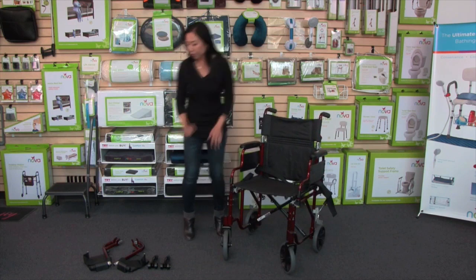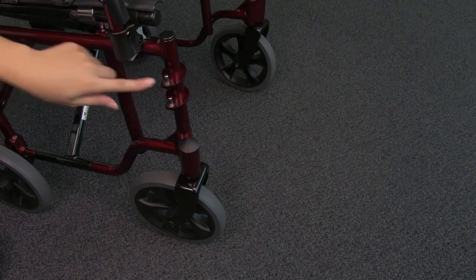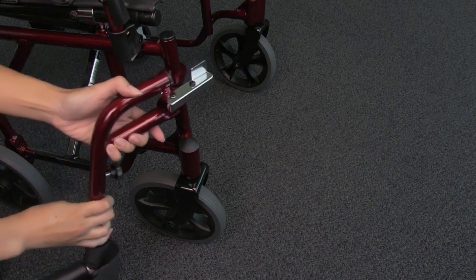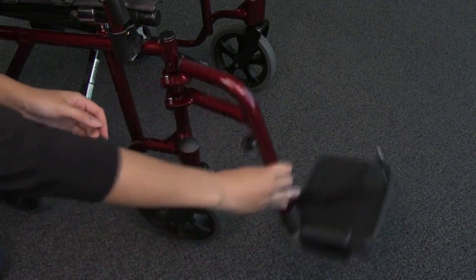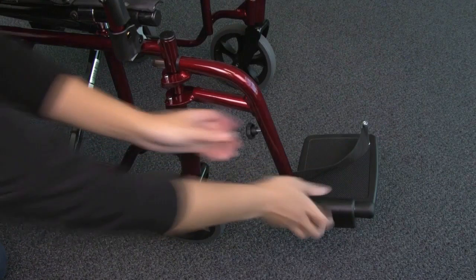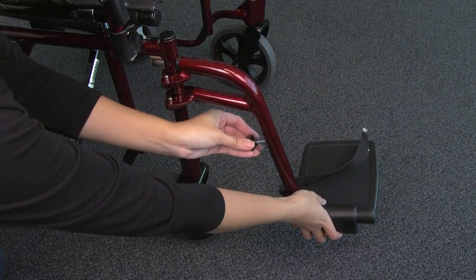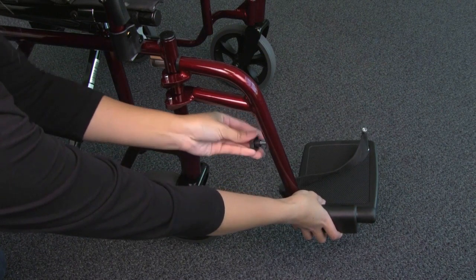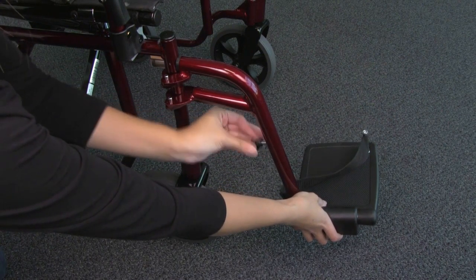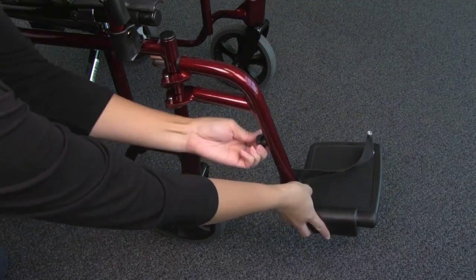To put on the footrests, you'll have two footrests, one for either side. You'll want the footplate to face inward, and you're just going to hang it over the pins and lock it in place. Notice the lever here is the same lever you'll use to release the footrest. It's so easy to adjust the footrest — we have an adjustment pin here. You're just going to fully unscrew it, then adjust the footplate to your desired height, and make sure it's nice and tight.